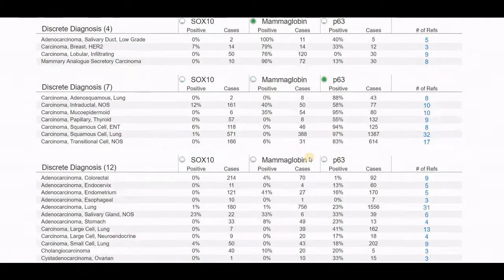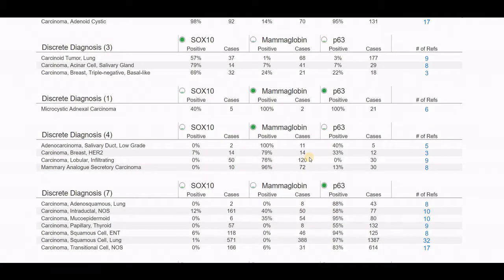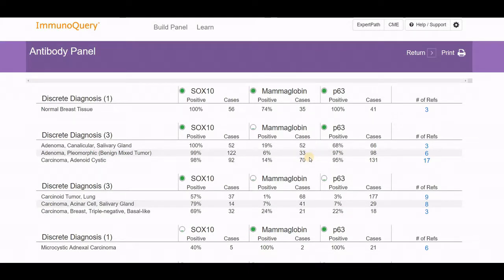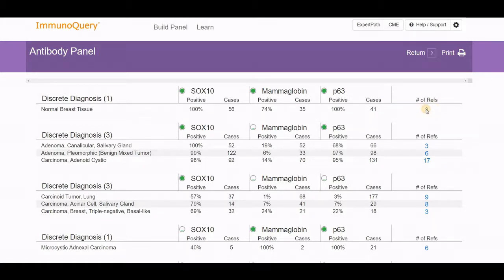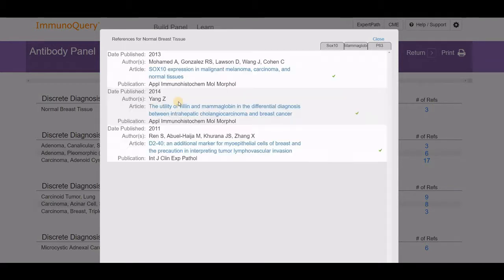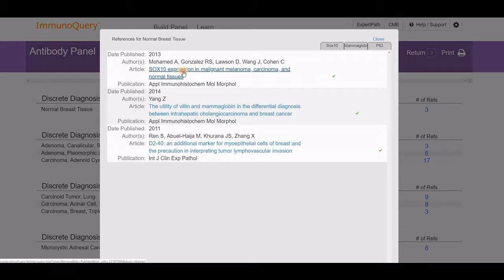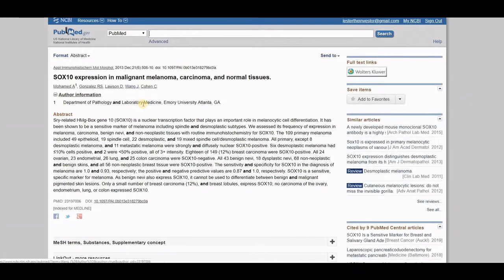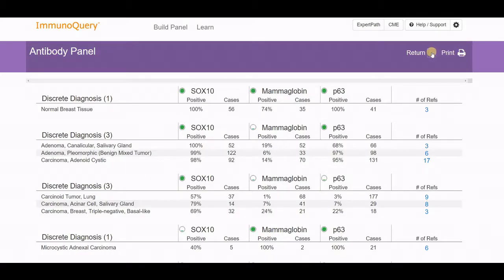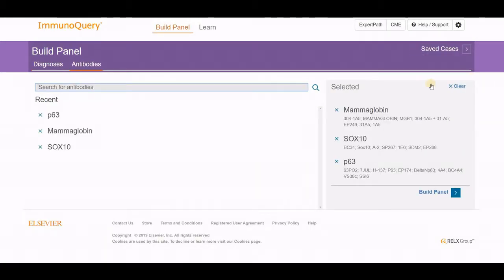This is something where perhaps you had five or six immunohistochemistry studies performed and got results back and you're not quite sure what that's supposed to mean. Is there something I'm missing or should have thought about instead? Again, references are available. You can click on references and it pulls them up, allowing you to look at that particular reference. Clicking the link takes you to PubMed for that topic. A useful function and definitely quite helpful in that setting.